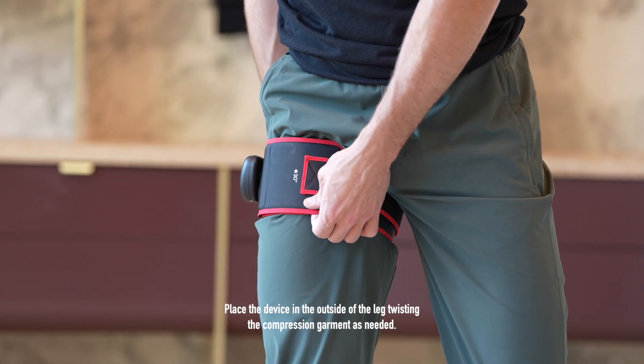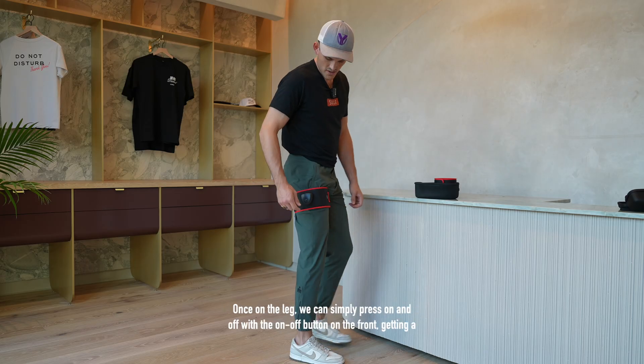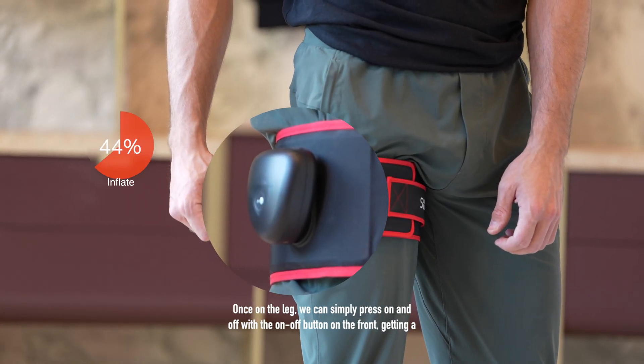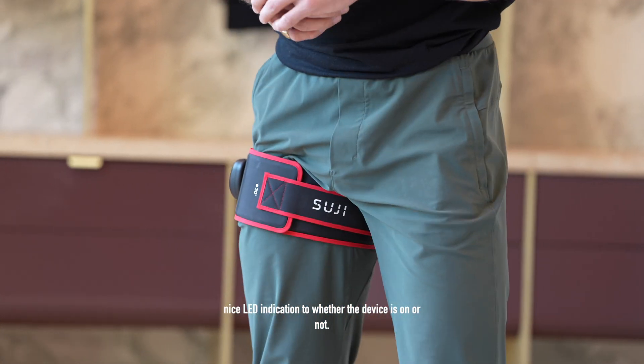Place the device on the outside of the leg, twisting the compression garment as needed. Once on the leg, we can simply press on and off with the on/off button on the front, getting a nice LED indication as to whether the device is on or not.